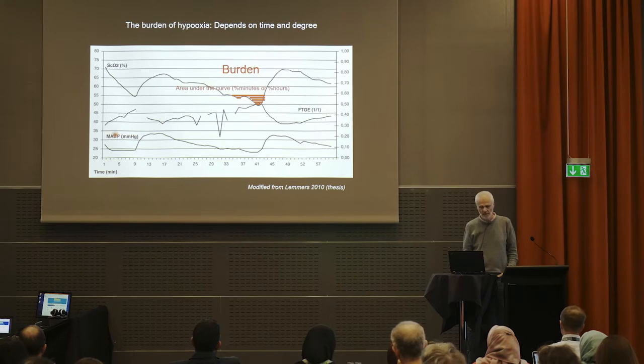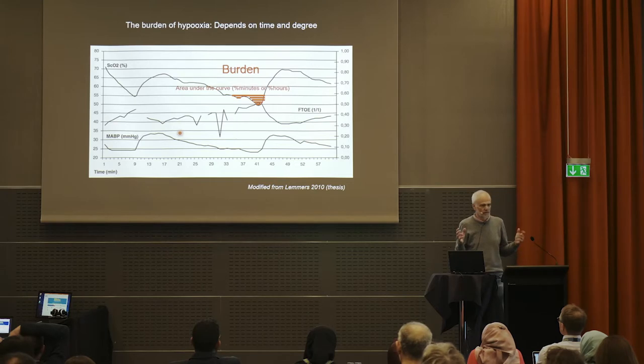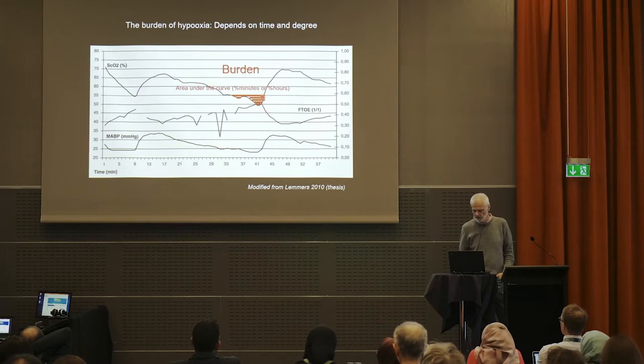And in this particular baby, this is a blood pressure trace. So it's quite clear that in this baby, blood pressure seemed to be very important. And this response suggests that this was a volume bolus. It is the kind of response you expect to find on a volume bolus, a transient effect on blood pressure. For the purpose of our trial, we defined the burden of hypoxia, cerebral hypoxia, as the area under the curve under 55 using that particular system. And our question then was, can we reduce that burden if we monitor cerebral oxygenation?